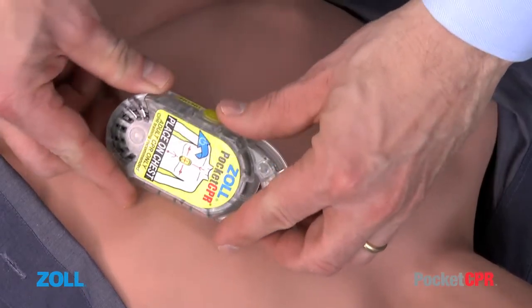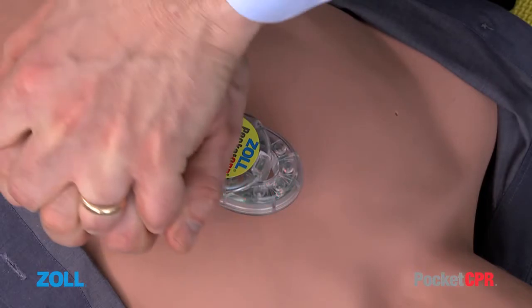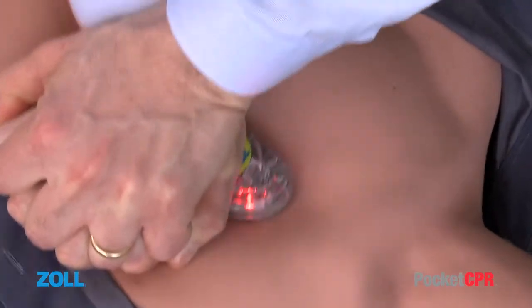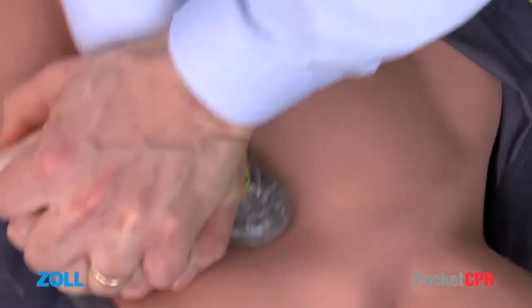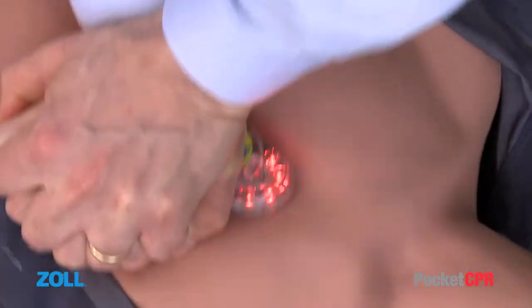If compressions are started immediately after powering up, the device will jump ahead to the Start CPR message. Start CPR. It will begin to play the metronome and provide voice and light prompts on depth of compressions. Push harder. Good compressions.